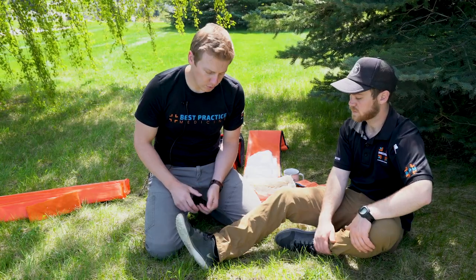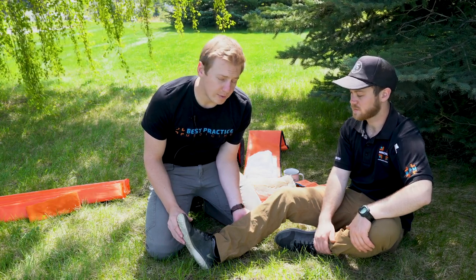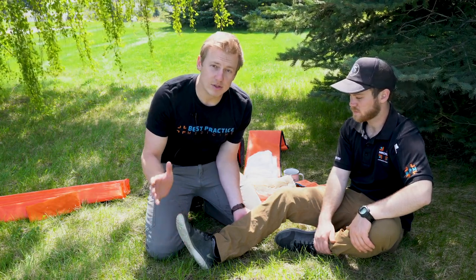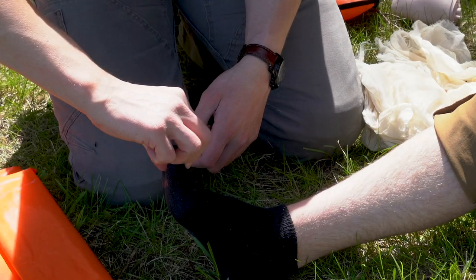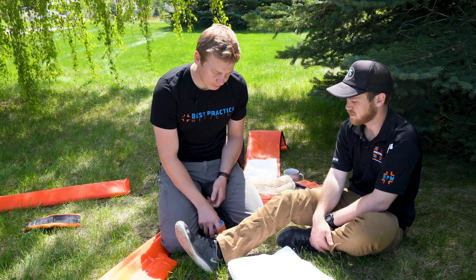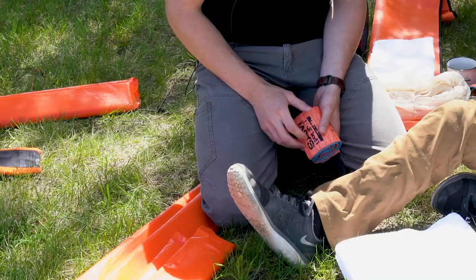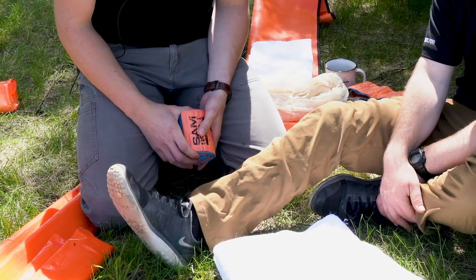First, we'll perform or direct manual stabilization of the injured extremity. Normally we'd have an assistant do this, but so you can see clearly what we're doing, we'll verbalize that for this video. Then we'll assess the patient's CSMs. Next, we'll select the proper splinting material. For an ankle, you can use a Sam splint, padded board splints, a soft splint, or other improvised material.